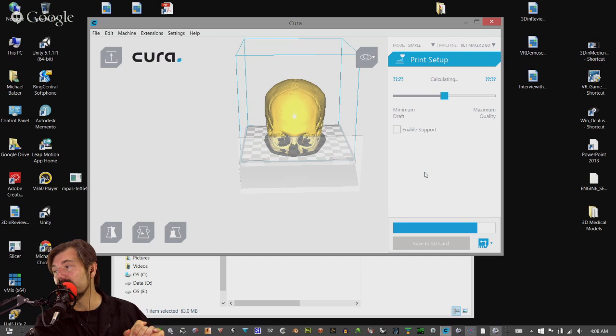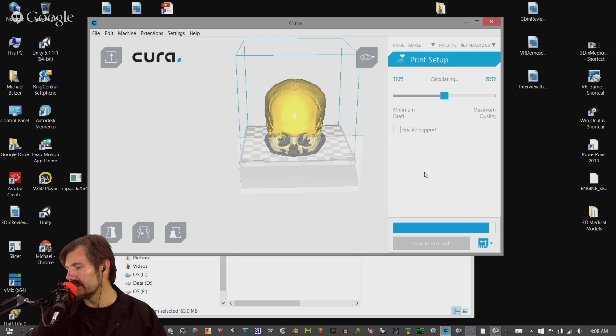As mentioned, it is low cost, but the caveat behind 3D Slicer is that it is not FDA approved. So if you do require something that's FDA approved, there are some other software selections out there. In fact, we just brought it up on a show, and I can't remember the name of it. I think Mimic is the big one. I think there's a fairly hefty price to that one, if I remember correctly. Yeah, when I looked at it.